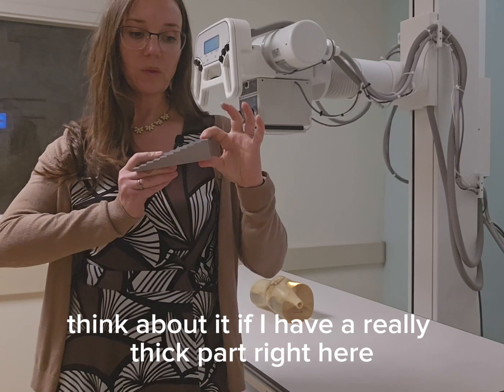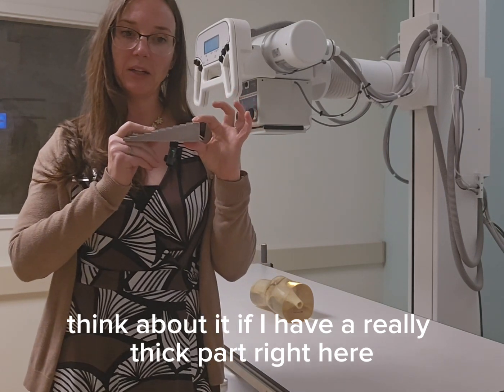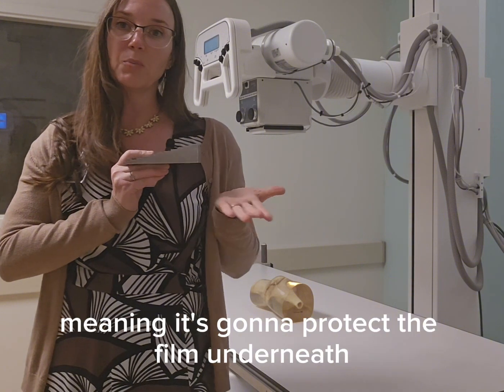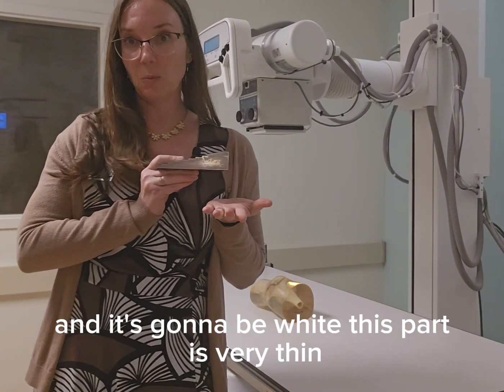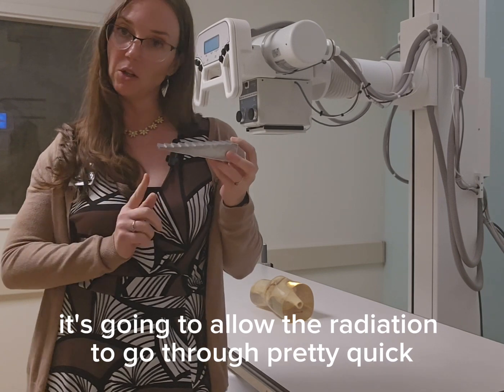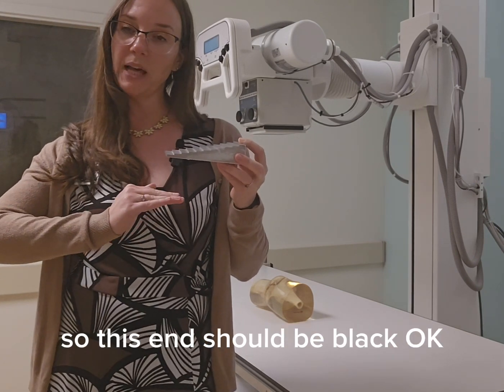Think about it. If I have a really thick part right here, it's going to attenuate all that radiation as it's trying to go through, meaning it's going to protect the film underneath and it's going to be white. This part is very thin. It's going to allow the radiation to go through pretty quick, so this end should be black, okay?